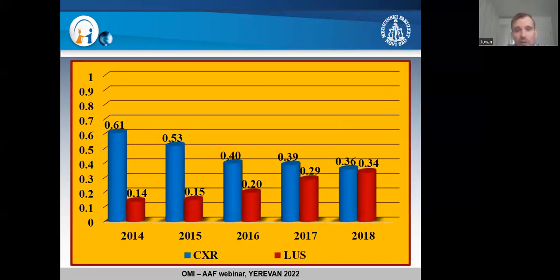And this is how it looked in 2014. You can see the number of chest X-rays in comparison to lung ultrasounds, and 5 years later, they're almost level, just chest X-rays and lung ultrasounds at our pulmonology department.